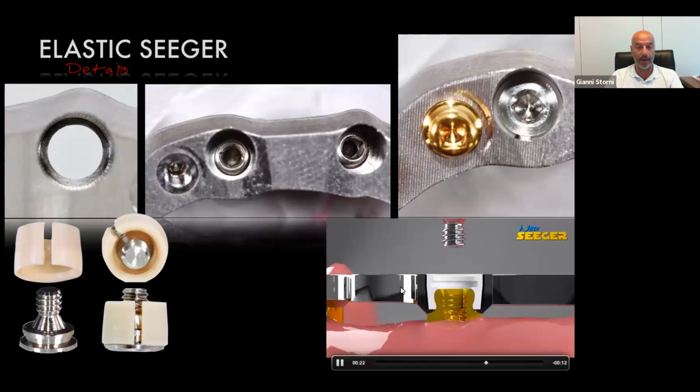to complete the bar easily. Because always you have the equator head. Always the equator head, doesn't matter which implant you are using. The head, the platform, is always the equator. So no X, no internal X, no octagon, no trilobe. So always the bar fits.